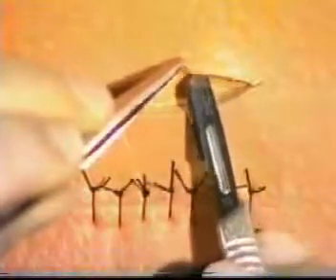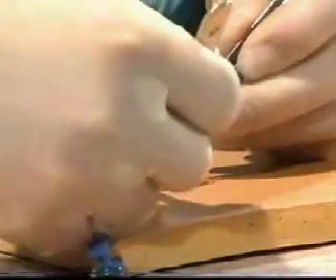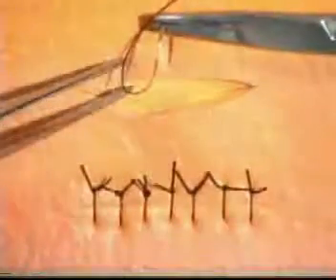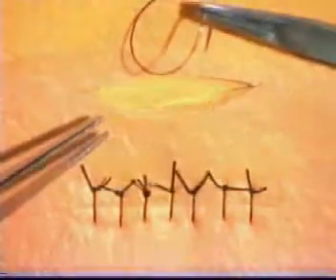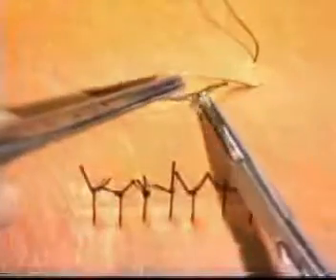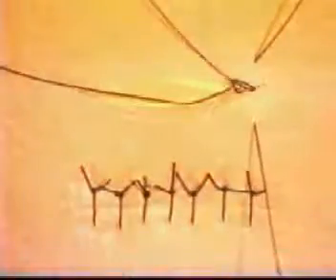It may not be possible to do this for an elliptical incision, and you may need to undermine the incision edges to increase mobility of the skin edge. In this situation, it is not practical to start in the middle of the wound, as such a suture will be under too much tension and therefore inaccurate. Thus, start at the end of the incision, inserting a suture at right angles and getting right down into the depths of the incision, then come back at the other edge of the skin, again at right angles to the skin edge, and ligate that particular suture.